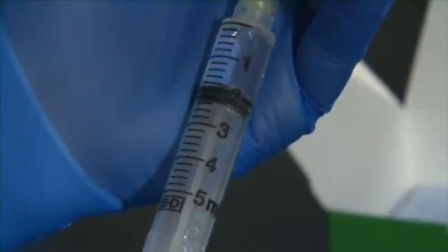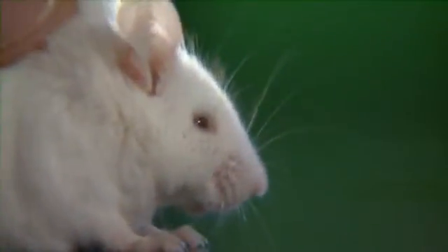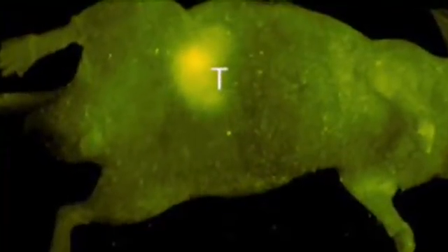They're also lifelike and injectable, making them ideal for preclinical animal studies in advance of human clinical investigation.